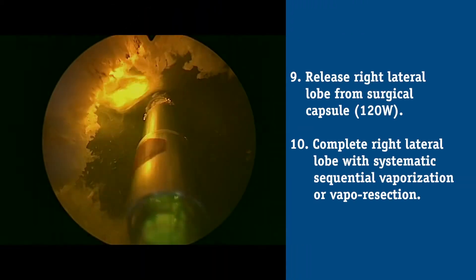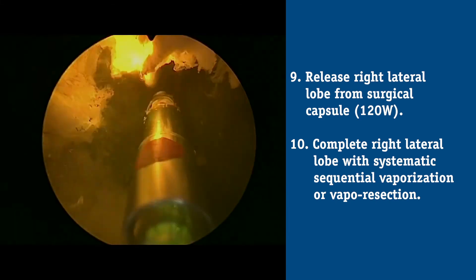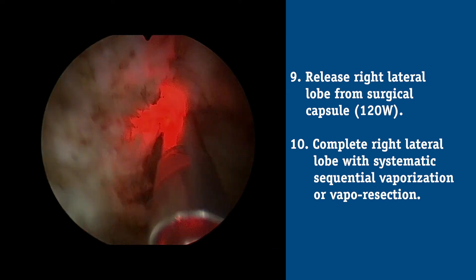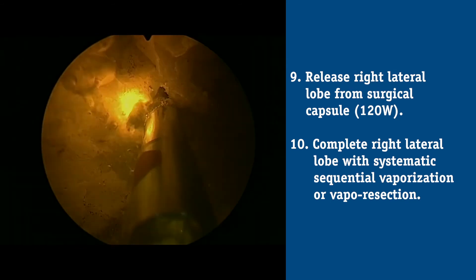Once I'm done treating the left lobe of the prostate, I turn my attention to the opposite side and repeat those exact steps — making a laser groove or incision between 11 and 9 o'clock, dropping that lateral lobe down, demarcating the bladder neck and the distal apex, and then turning up my energy again and removing the tissue between those grooves until you have a nice smooth surface.